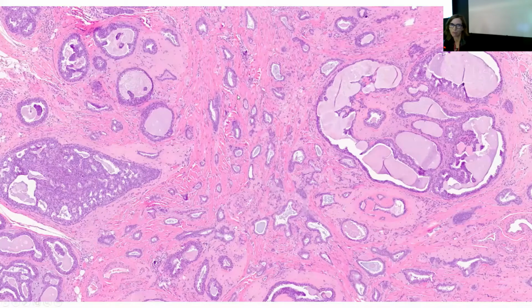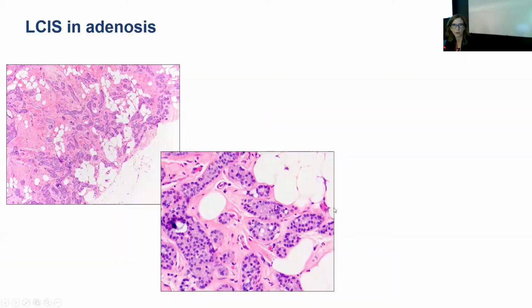These are very often older patients. But there's more of a haphazard distribution to how these glands are distributed within this field here. It doesn't look like small glands within the center, confined to the center. They are percolating out and about. And then I think that there's some cytologic atypia in the in situ process here.